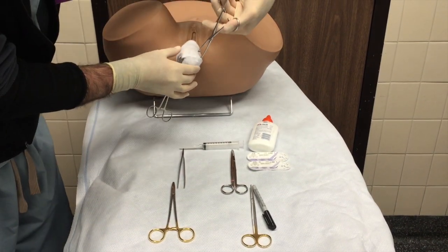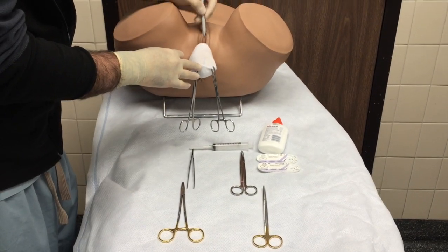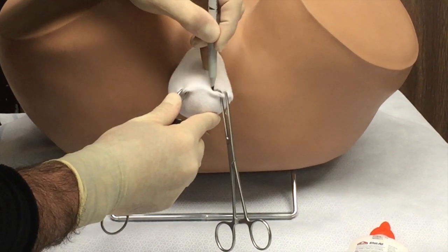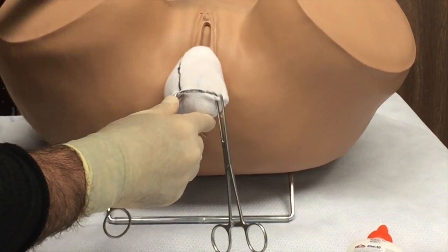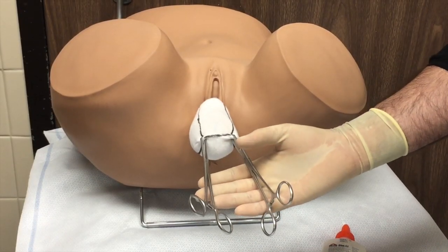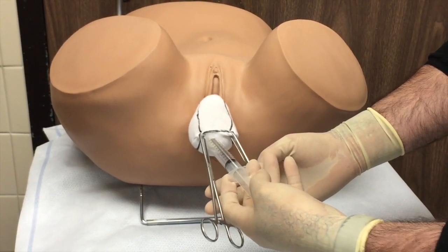We begin by attaching Allis clamps to the apex of the prolapse. We then draw rectangles for anterior and posterior dissection from the apex to the hymen. The planes are then hydro-dissected using lidocaine with epinephrine or vasopressin.